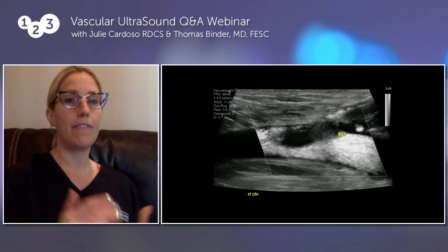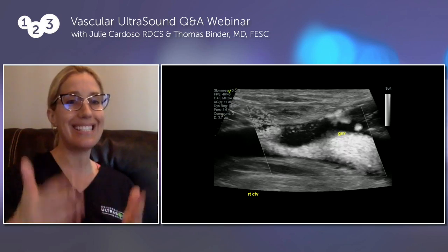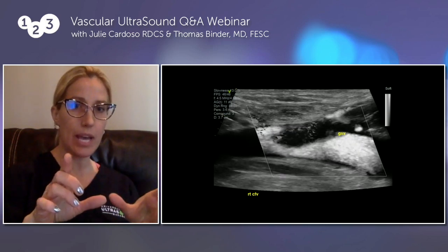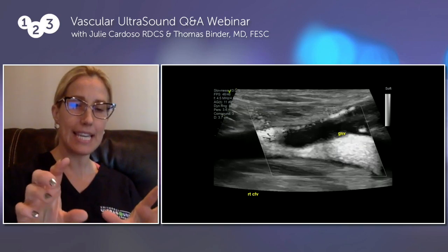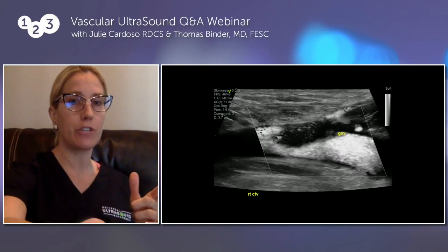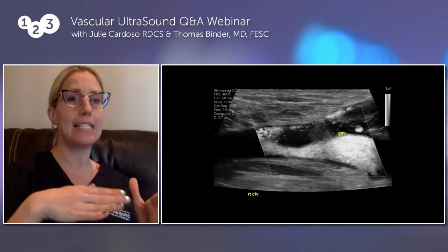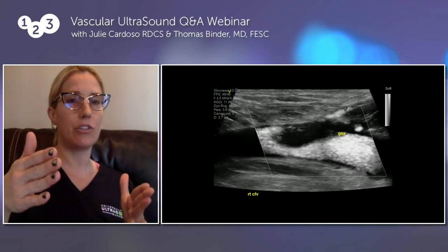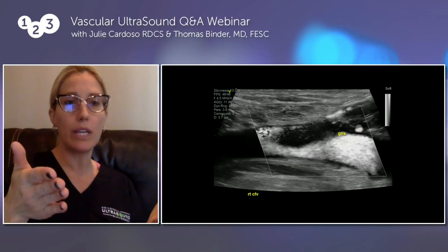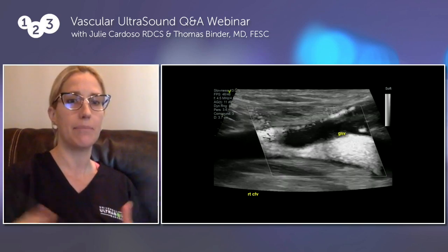Well, this is a feature on an ultrasound system that I utilize instead of color flow imaging. It gives me an angiographic view of the tissue of the thrombus, and I can really see where the flow is and if there are collaterals maybe. And you can see on the top portion of your screen, there's flow right above the thrombus extension in the great saphenous vein. So this is very helpful as I surveil the patient as they're going through management. Because again, we're going to see patients like this every week to see how the thrombus is progressing back into the superficial system and dissolving.